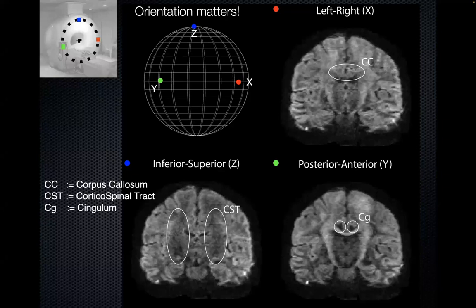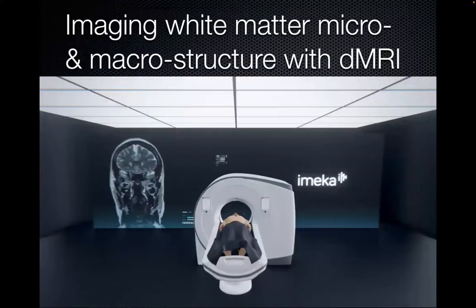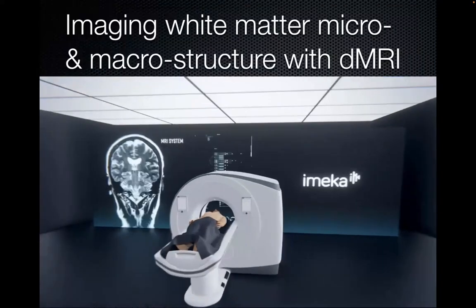And that's why we're moving past the concept of just speed, apparent diffusion coefficient, which was just a number, right, in stroke. No matter what the orientation, there's a stroke, you have a big blob, you're sick. Here, we're trying to refine the methodology to get at each voxel the orientations of our axons. And the next step is the integrity of our axons, right? The amount of myelin, the amount of axons, the amount of water. And so, little sexy video.